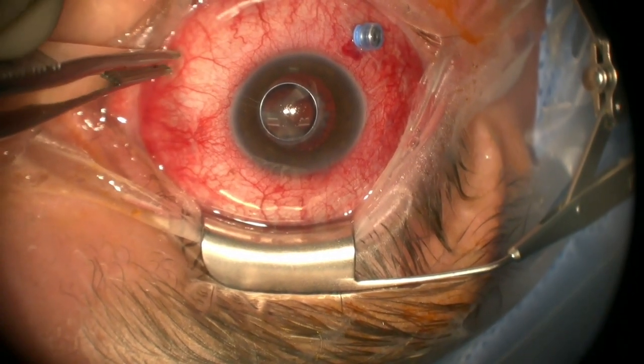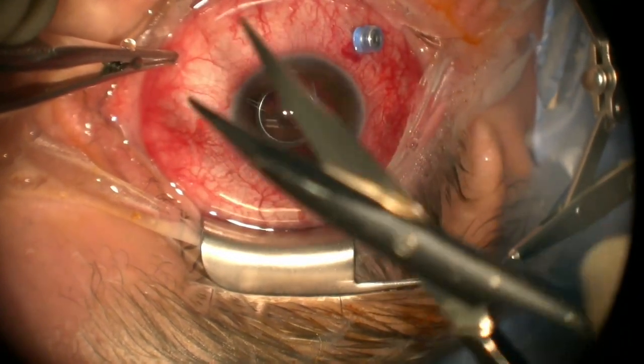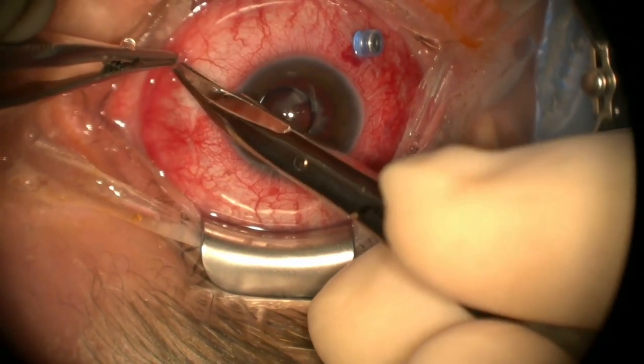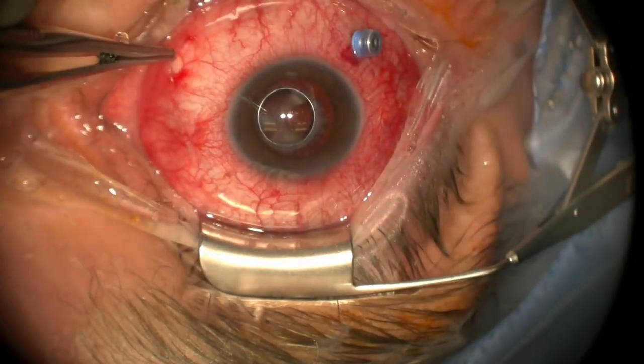I prefer to do a subtenons injection if possible. Eric, is that pinchy there? Okay, just hang on 1 second. We're going to make a little incision here and get you more anesthesia. So I think this is a nice way to show a little spread action there.